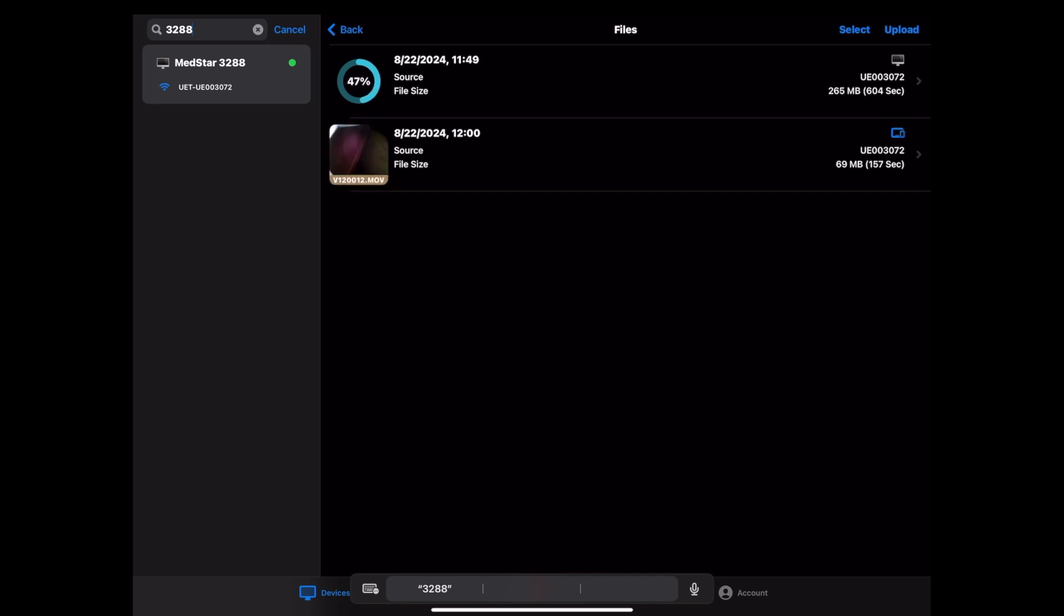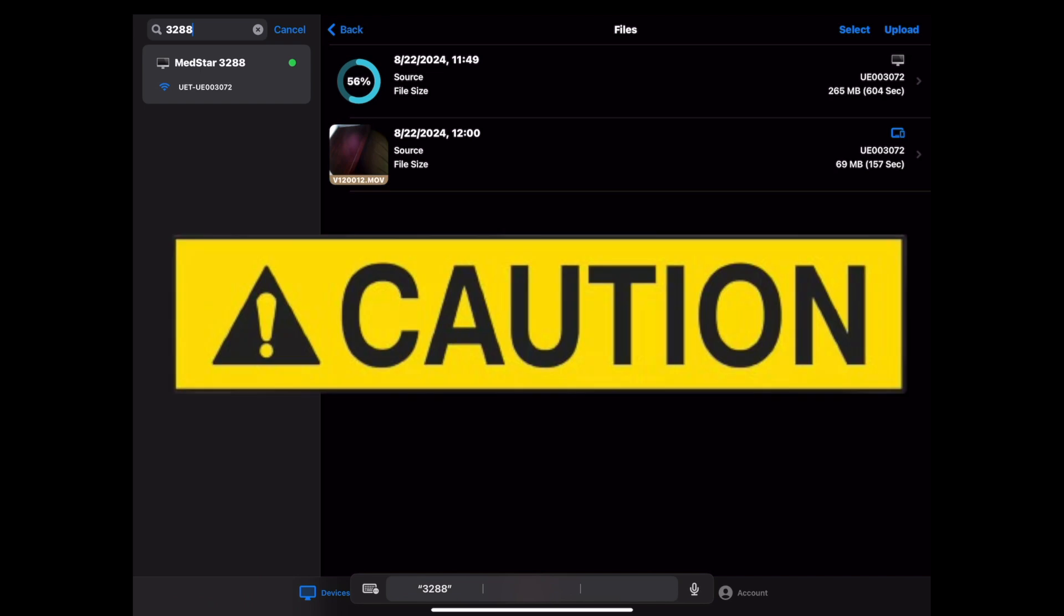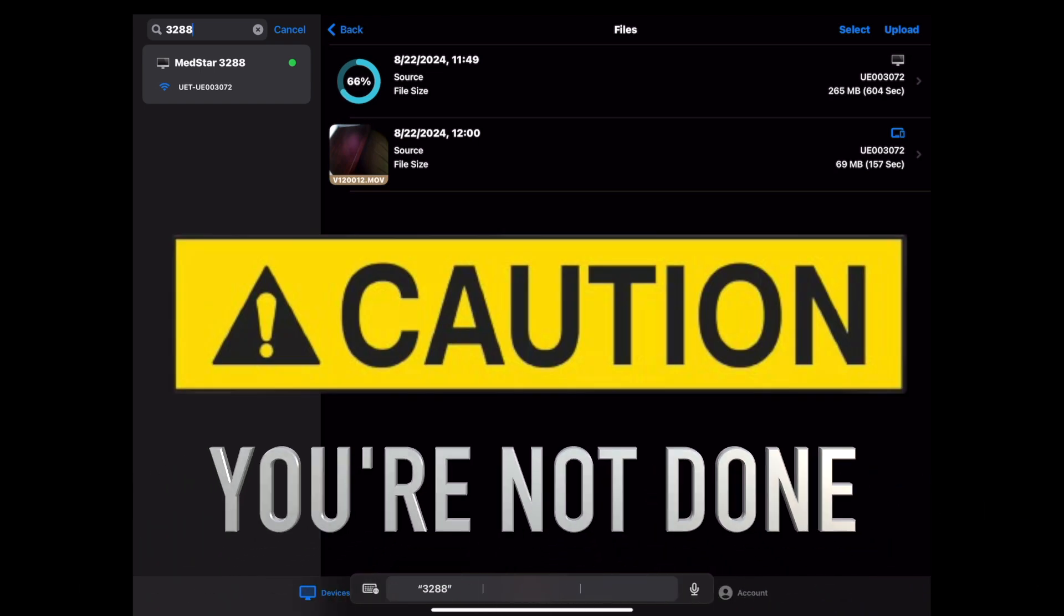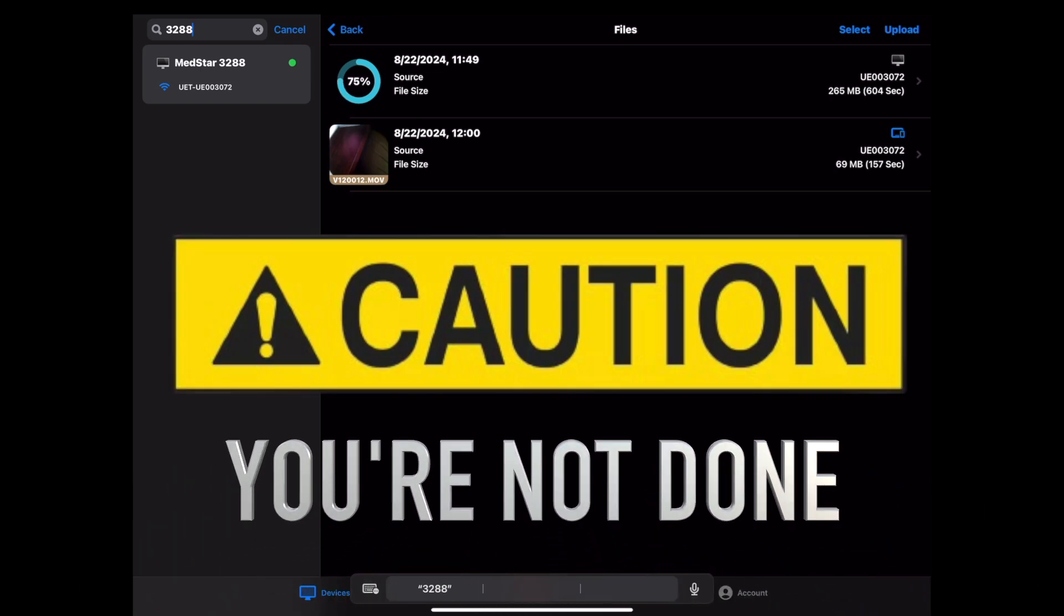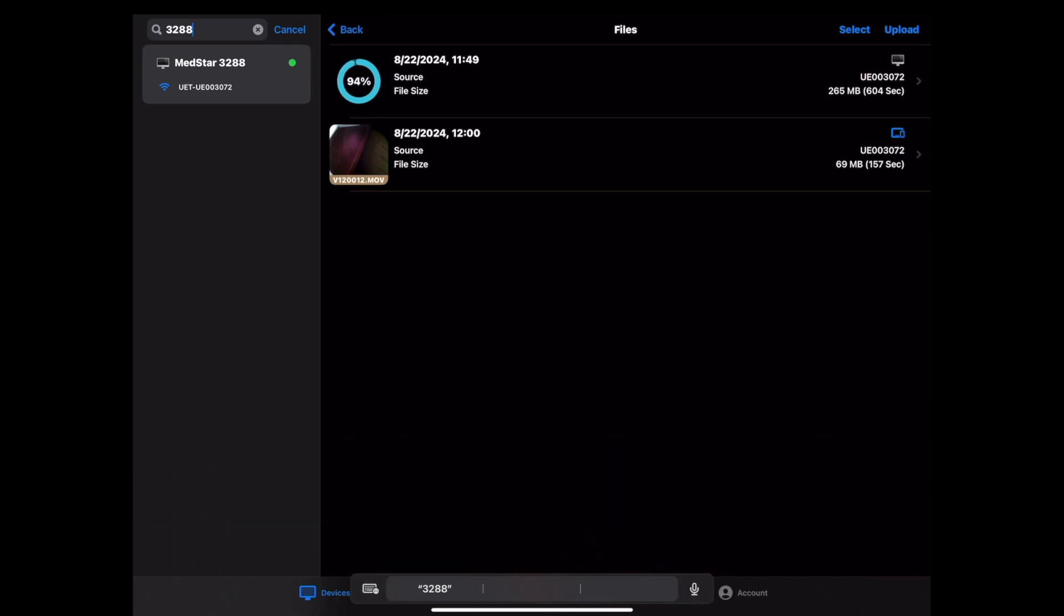A big caution here. You are not done once you see the videos have been loaded onto the app. This is only local copies and these are immediately deleted at the end of the session. You must continue with the full upload process to the VL cloud site for files to be retained and available to the OMD quality team.